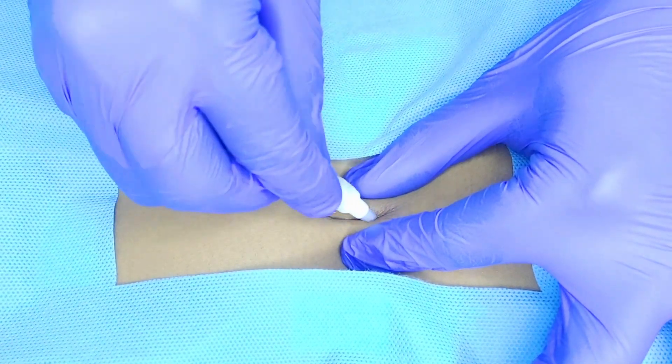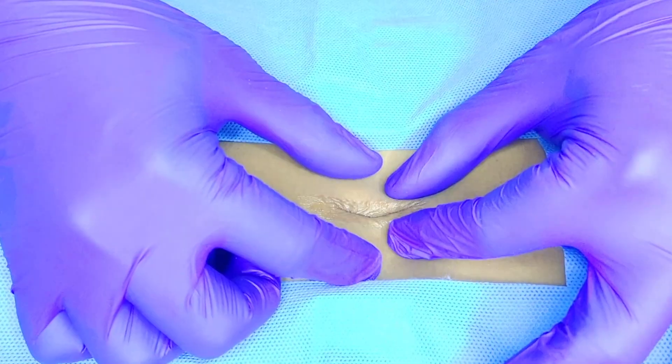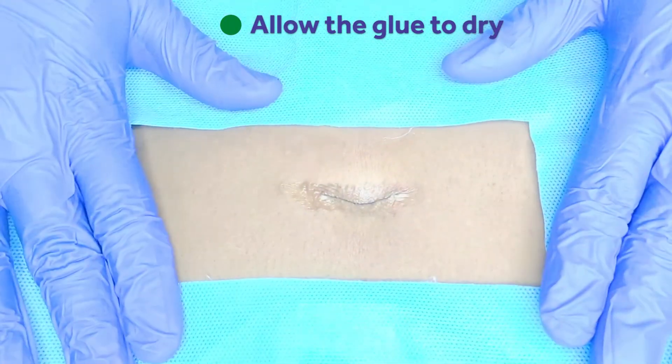Approximate wound edges with the other hand and apply glue continuously over the edges. Allow the glue to dry in about 10 to 15 seconds.